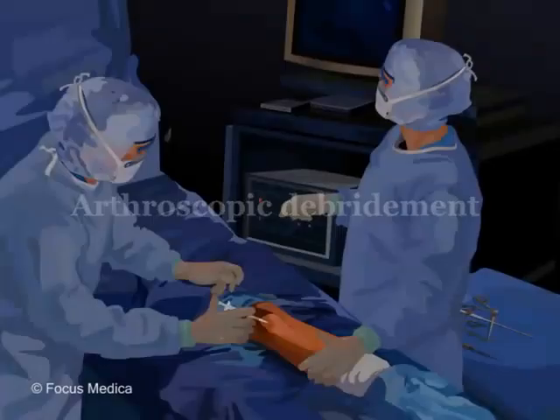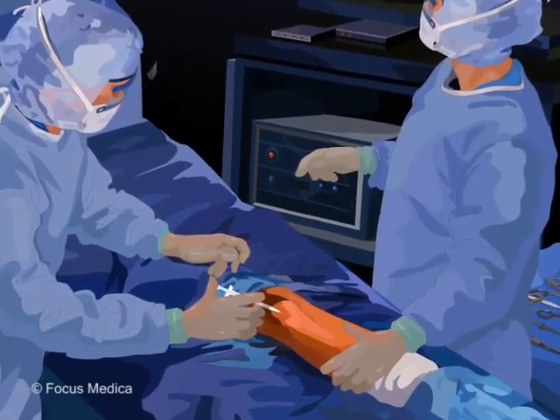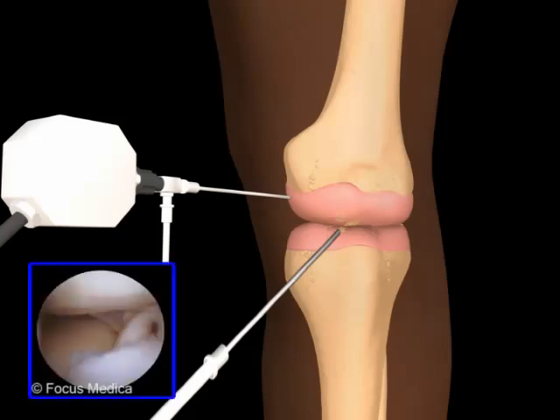Arthroscopic debridement: a local anesthetic is administered through a small incision, and a thin tube that has a light, a camera, and other devices attached to its end is inserted. The joint is visualized on a TV screen.